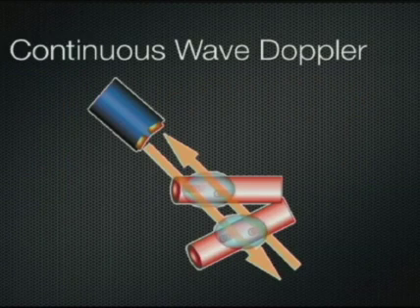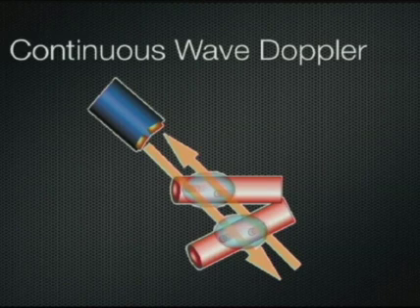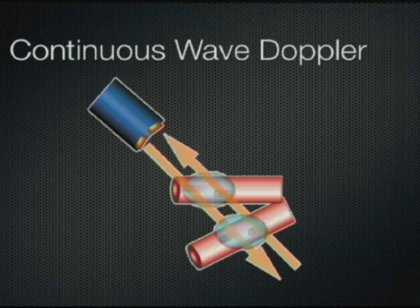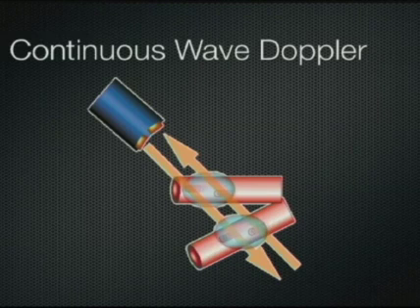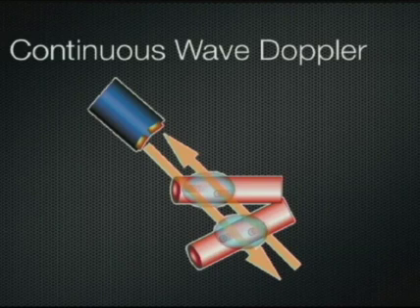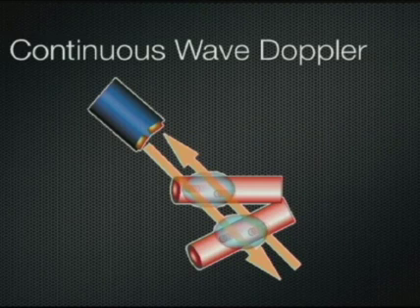Continuous wave Doppler is utilized for some simple blood pressure measurement devices and pulse detection devices, and typically employs two transducers, one transmitting the ultrasound energy, the other acting as a receiver. This is a sensitive way of detecting flow, but does not allow differentiation of the site of origin from which the flow is arising. In this example, two vessels lying near one another both produce components and contributions to the Doppler frequency shift, but with a continuous wave device, it is not possible to determine from which vessel or vessels the Doppler signal arises.